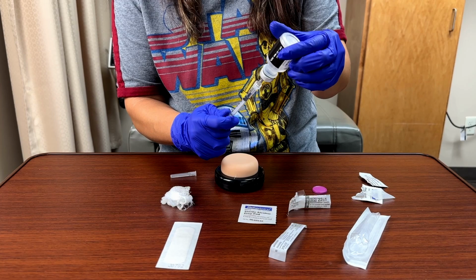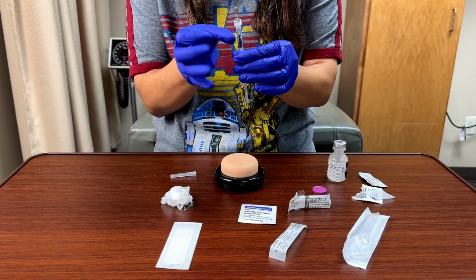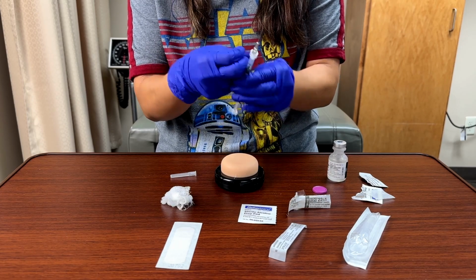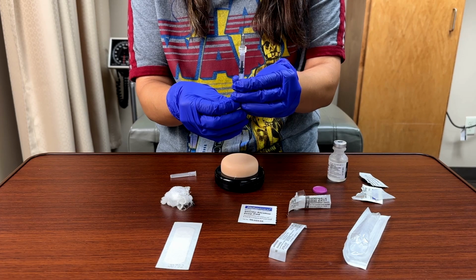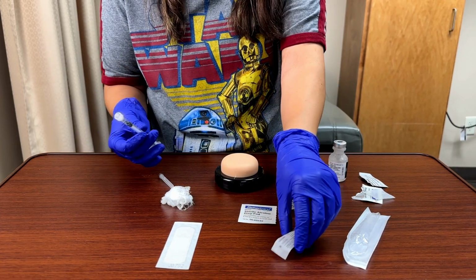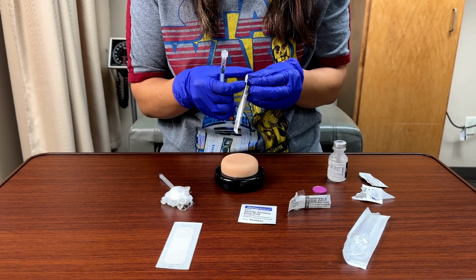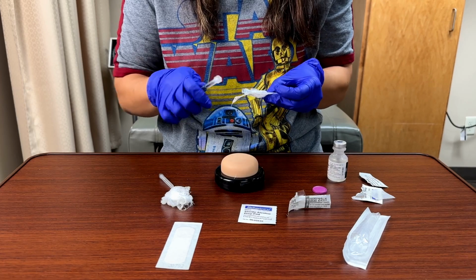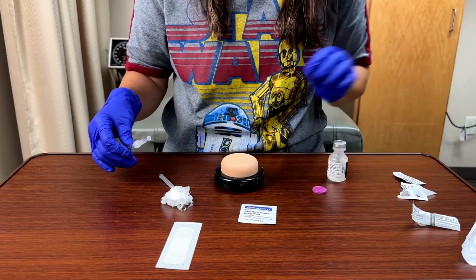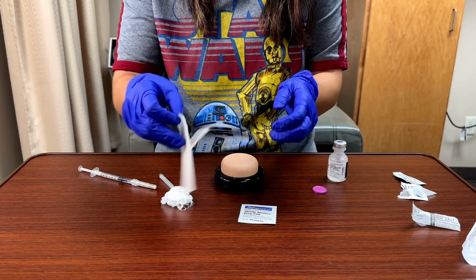All right, once I have that, I'm going to release. Okay, make sure that there are no air bubbles, that everything is where it needs to go. Okay, and then I'm going to replace my needle, take this one off, and I'm going to put on my injecting needle. All right, got my injecting needle, I got everything else to the side, have my cotton and my Band-Aid. I'm going to go ahead and open it so it's ready to go.